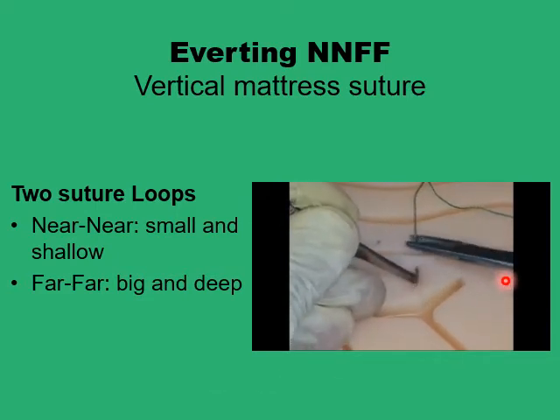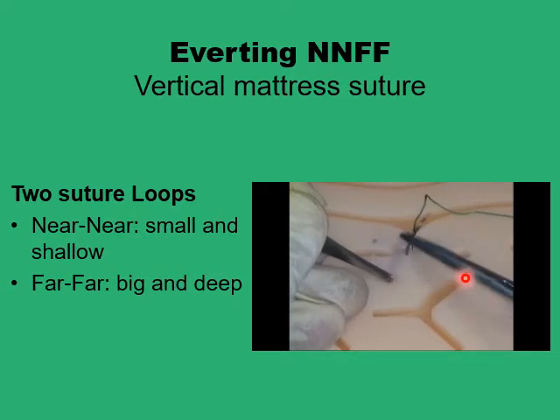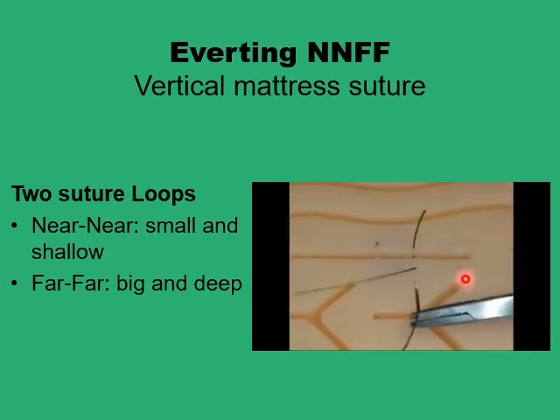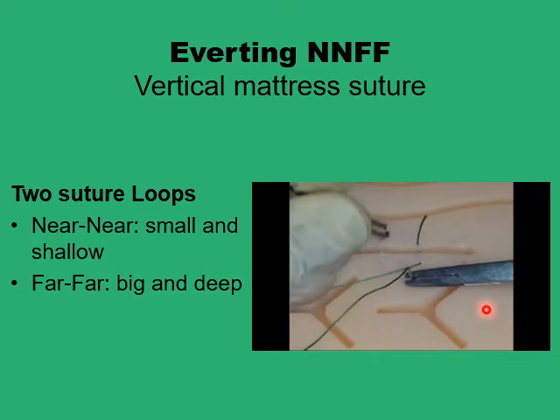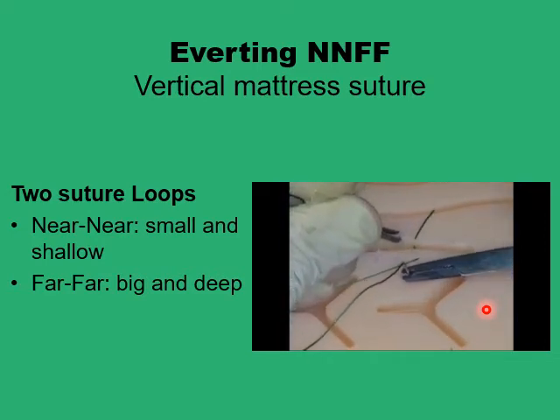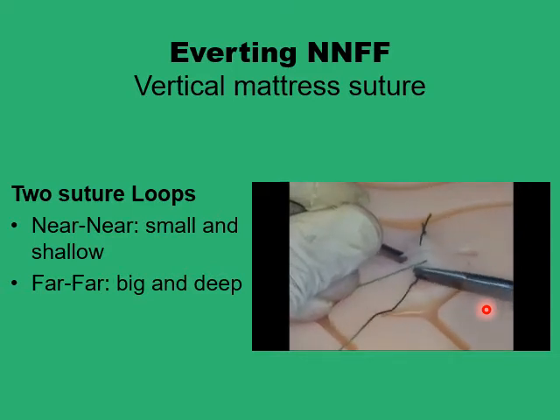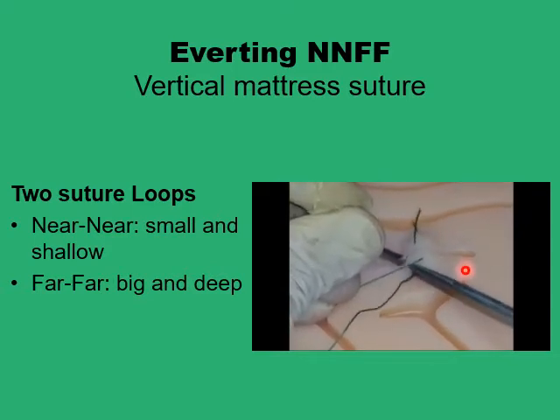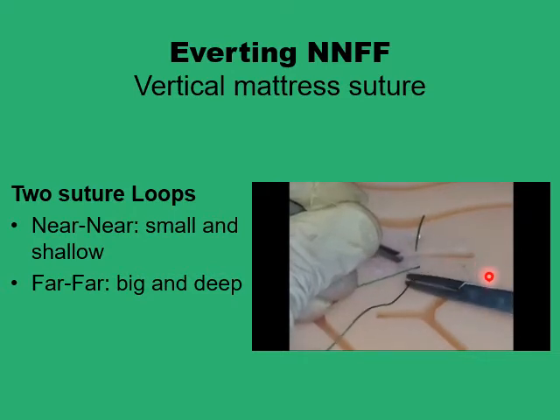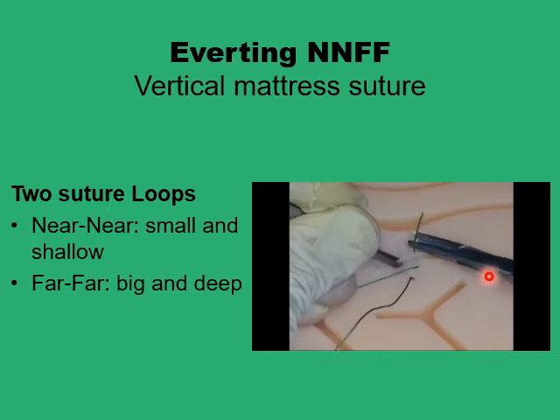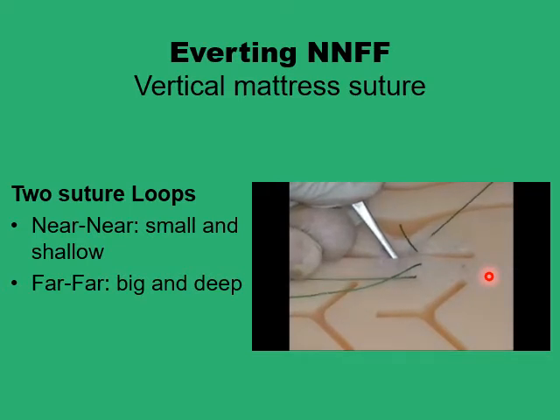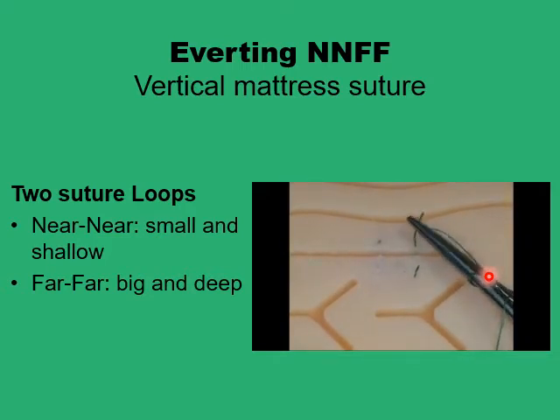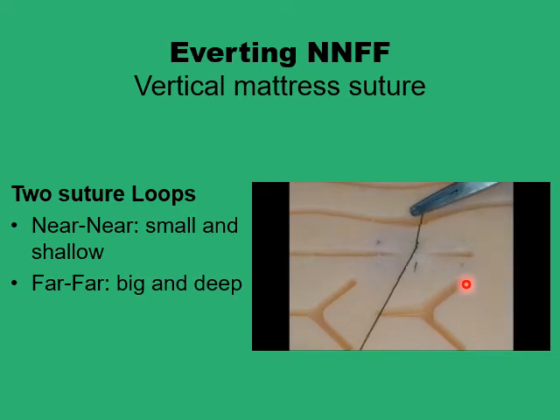Here you start by doing the near-to-near loop first, which is the shorter and shallower of the two, then go back a little bit and produce the other loop — the deeper and longer far-to-far loop. The advantage of this technique is that it gives better skin edge opposition, but it ends up producing a similar eversion to the traditional far-far near-near vertical mattress. Both produce a very consistent eversion of the wound edge.